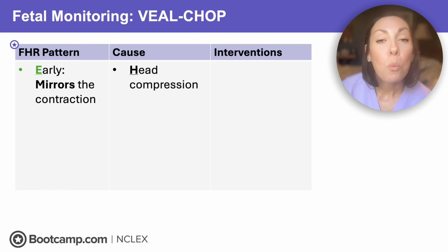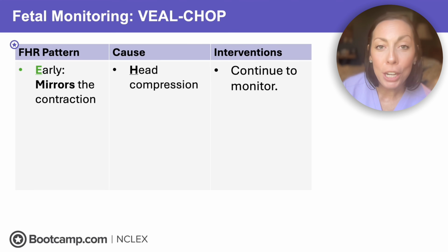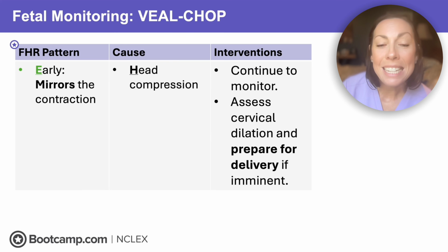So what will we do? Well, since these are okay, we'll continue to monitor, but we'll also assess to see the cervical dilation and prepare for delivery if it's imminent.